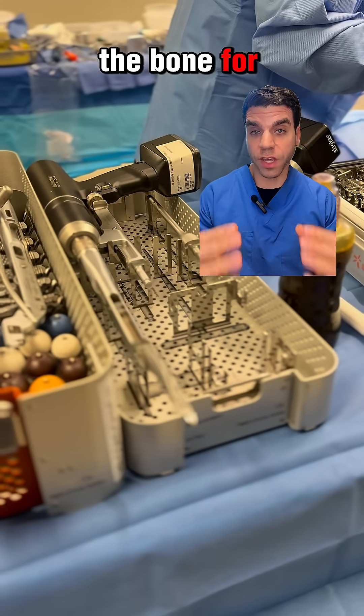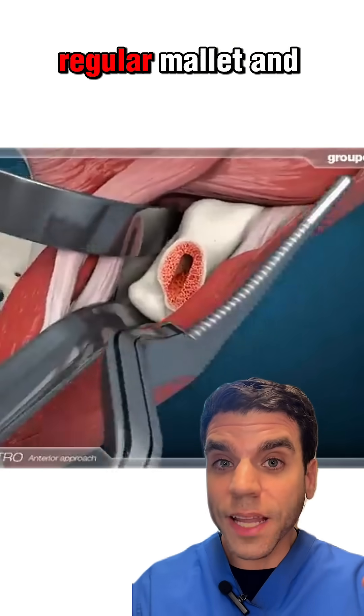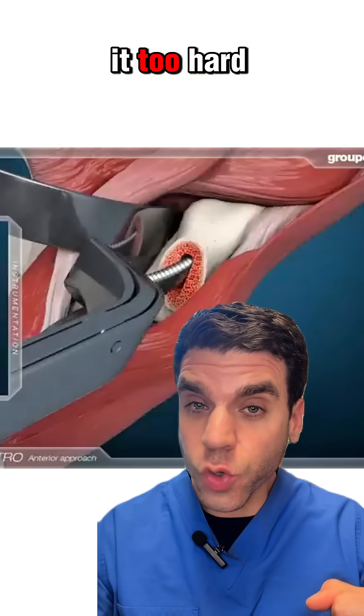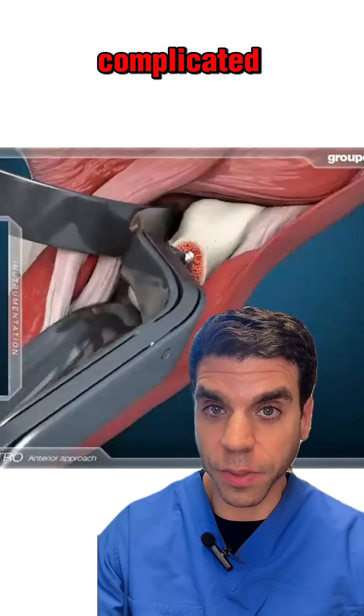When I'm preparing the bone for the hip replacement, I have to shape the inside of it to fit the implant. Before, I used to use a regular mallet and hit it in blow by blow. The only problem with that is, if you hit it too hard or you do one wrong tap, you risk breaking the femur and making the surgery much more complicated.